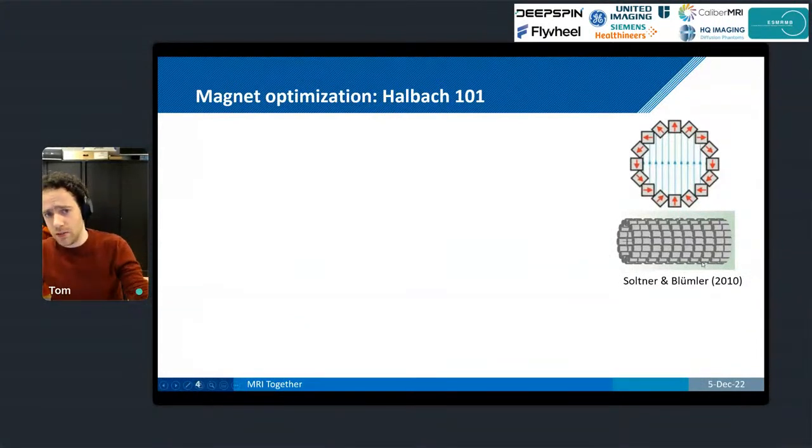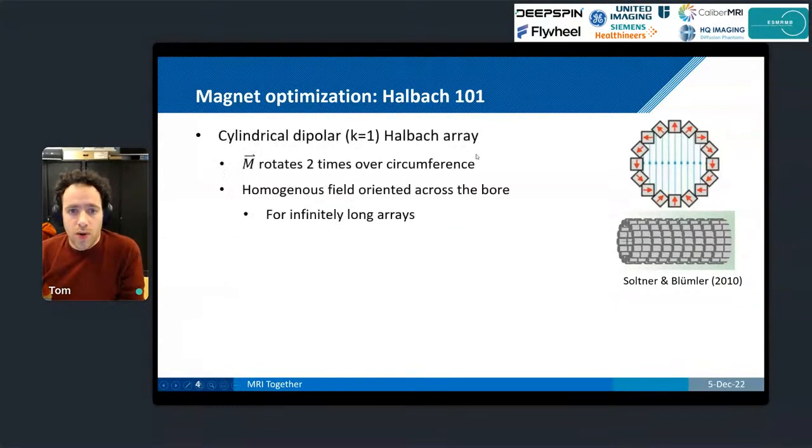So the rest of the magnet talk will be about Halbach arrays. I know that Clarissa is also giving a presentation later on the tabletop system, which will use a yoke magnet, so you get to see the construction process of that as well. So, Halbach arrays.